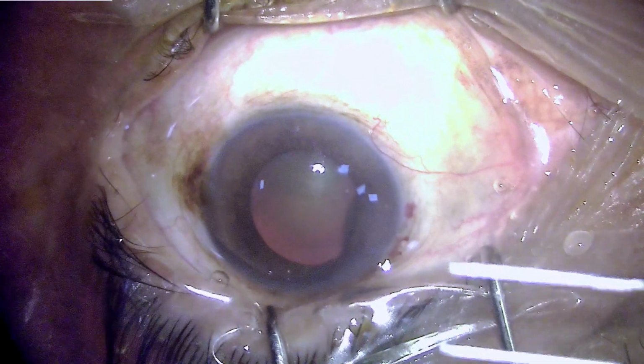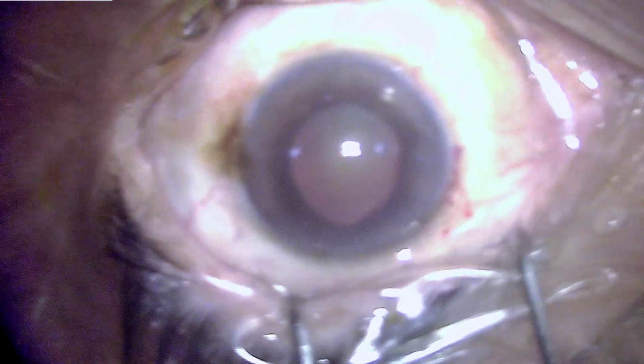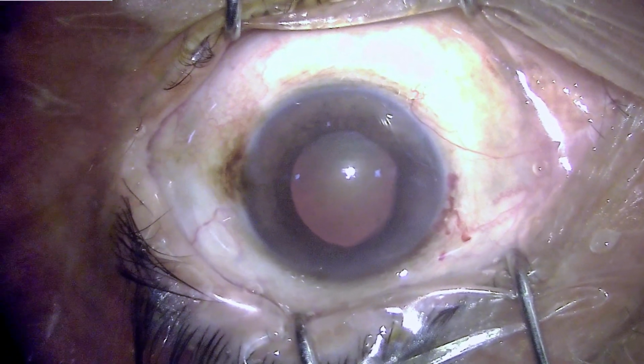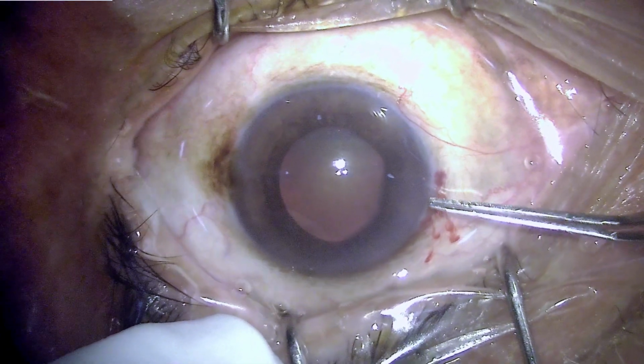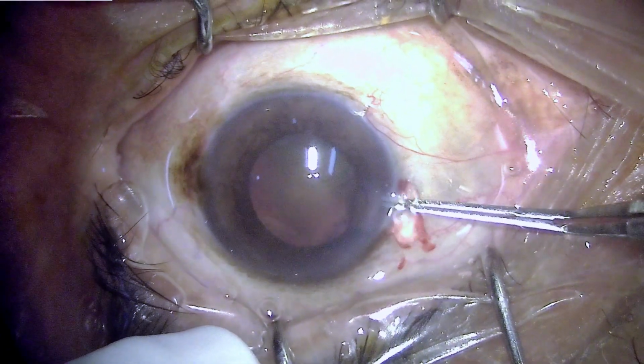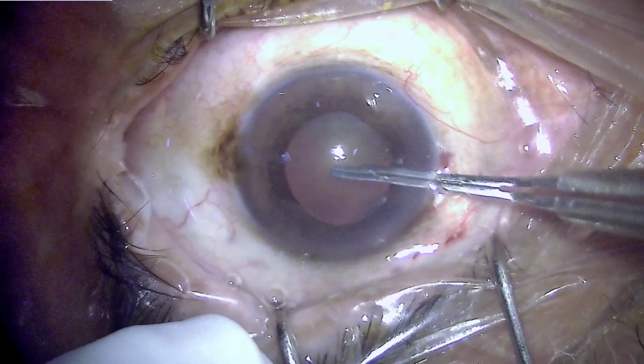microscope illumination light. The viscoelastic gel has been instilled, and at this moment the pupil size is something like 6 millimeters, and the microscope is again being adjusted. I noticed that once I had pulled up the microscope far away from the patient, he was able to recognize the source of illumination better and fixed better.